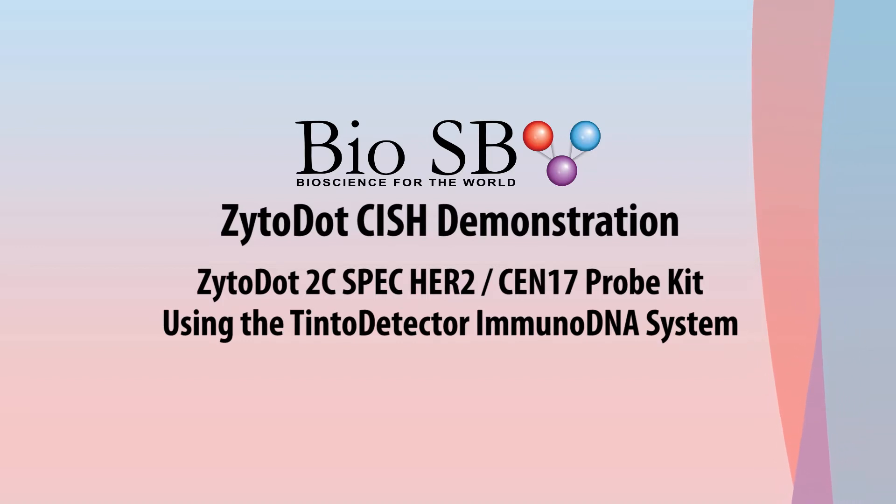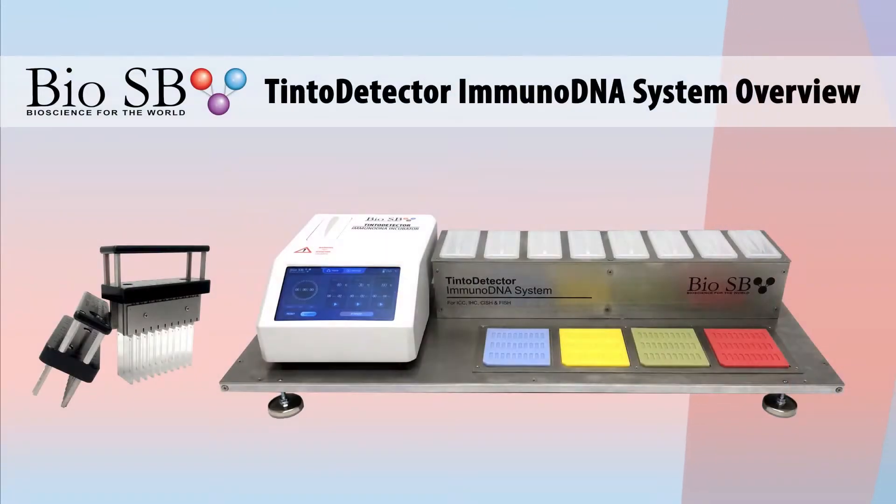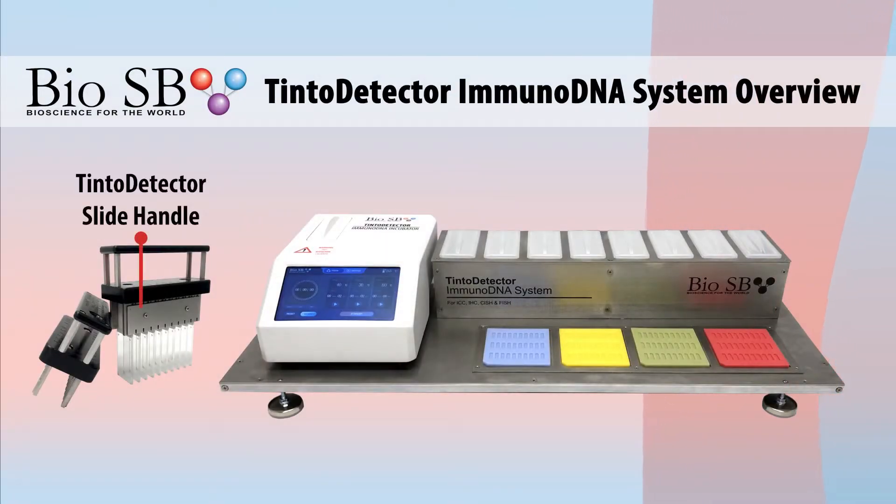Today we will be doing a demonstration of a ZytoDot 2C SPEC HER2/CEN17 Probe Kit using the BioSB TintoDetector.